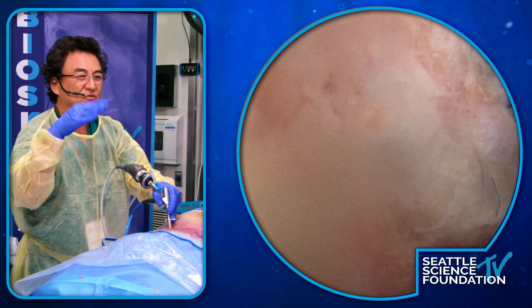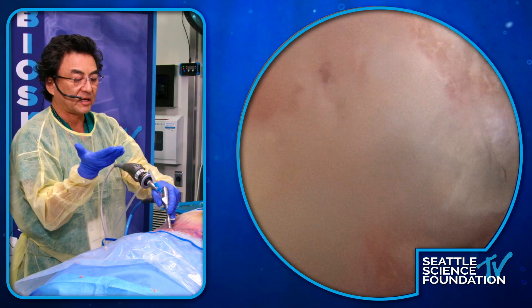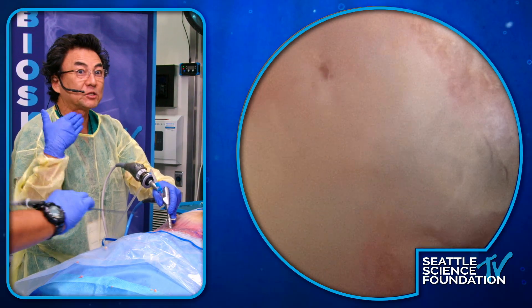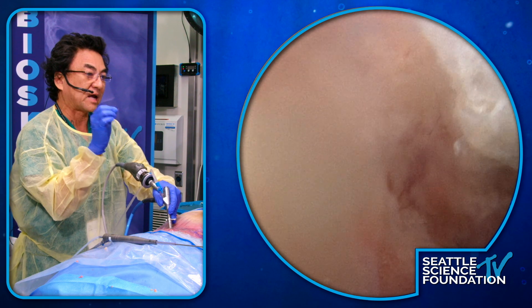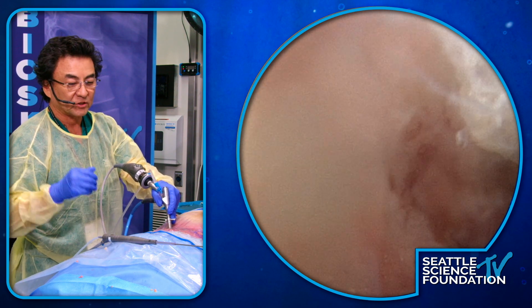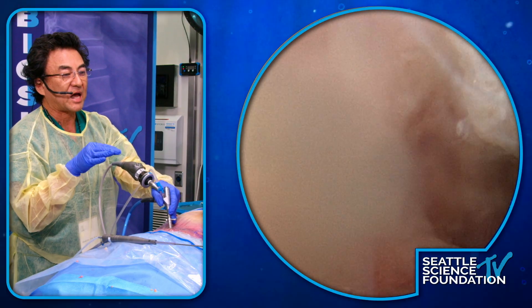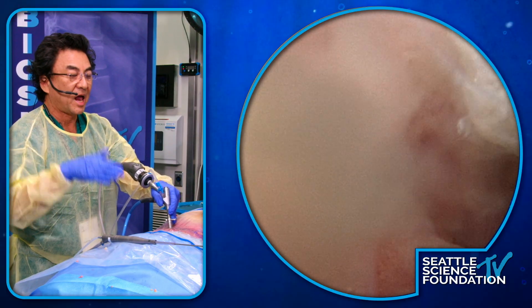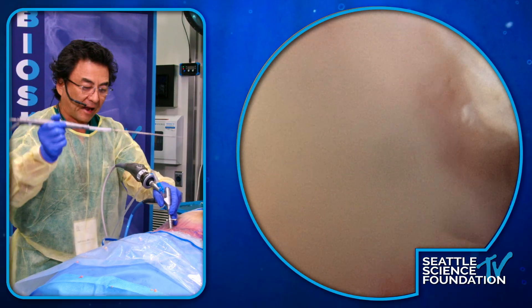It's really useful when I get right next to the nerve roots. When I use the spinning burr, two things happen: number one, there's a lot of snow from the bone debris which momentarily makes it very difficult to visualize the nerve root, and number two, it's a spinning device, so if I slip I could scratch the exiting nerve. So having an ultrasonic bone tool avoids that spinning instrument and produces much less snow.